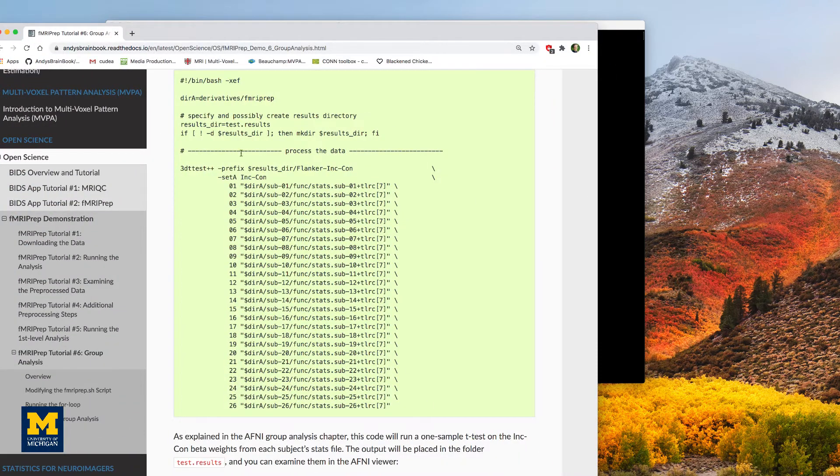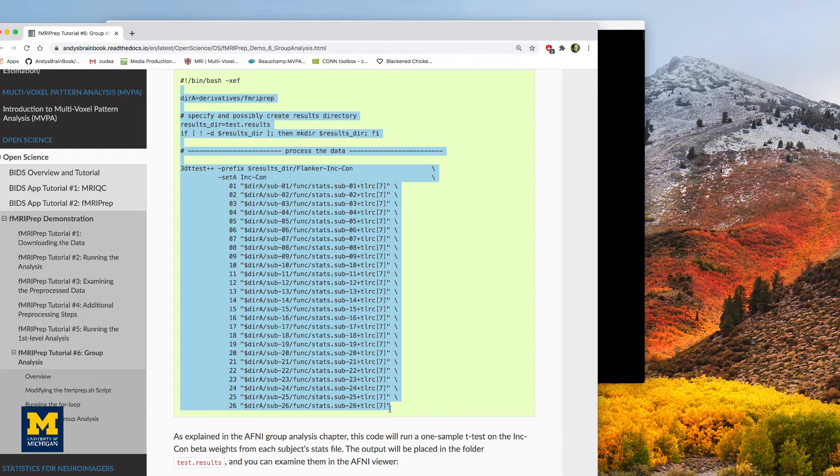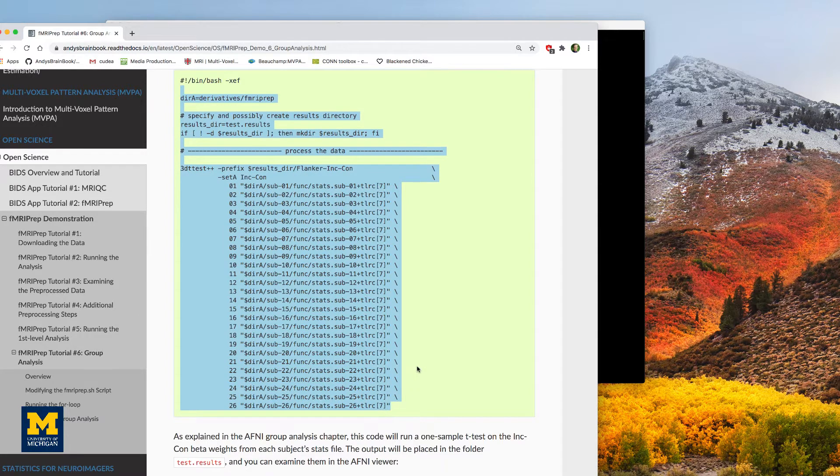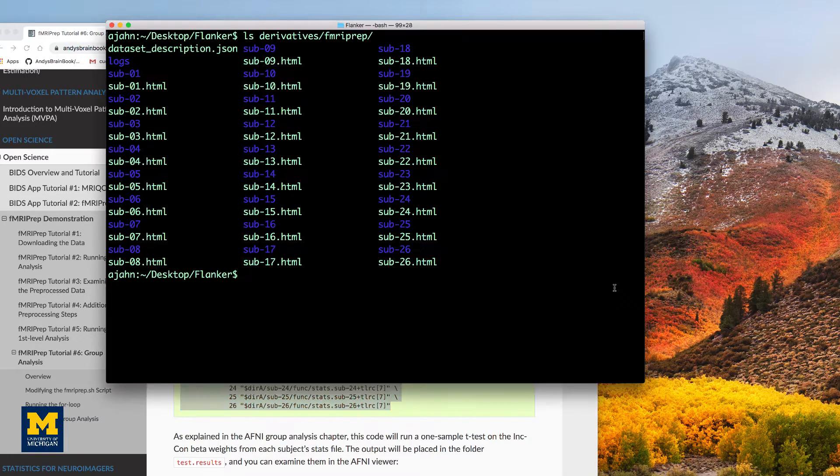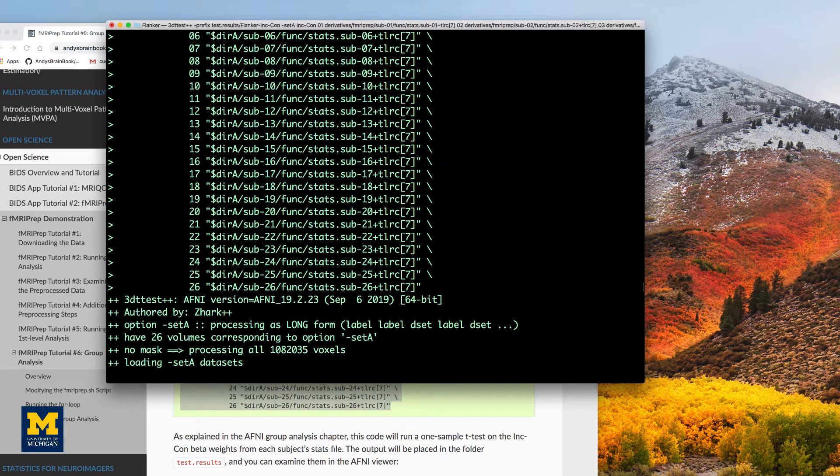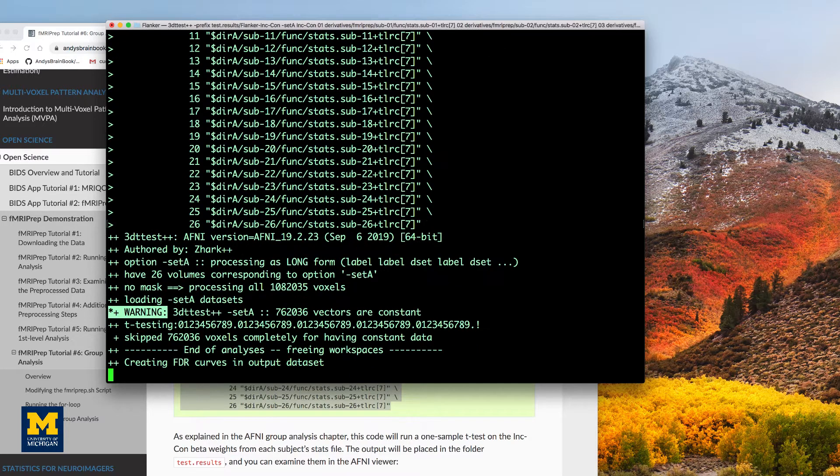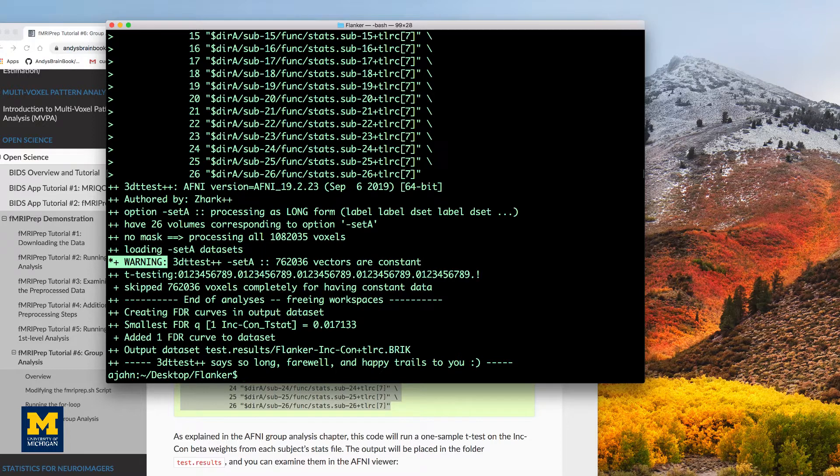And the code for this group analysis will look like this. As explained in the AFNI chapters, this code will run a one sample t-test on the inc-con beta weights from each subject's stats file. And it will be output in a folder called test.results.